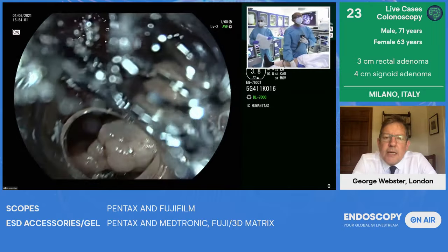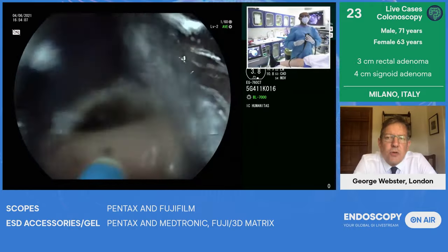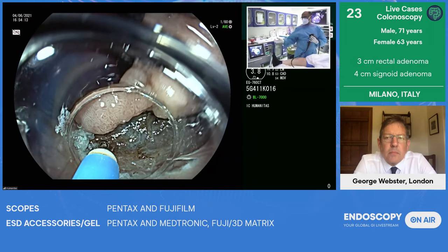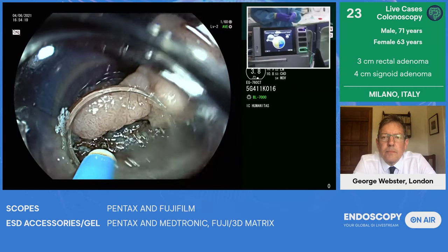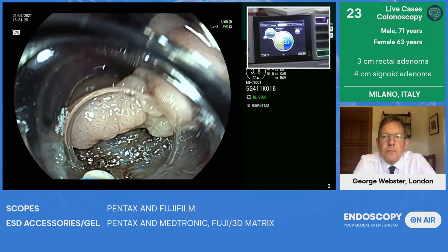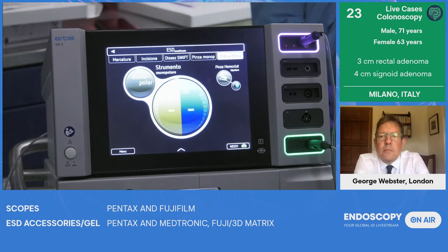Pradeep, do you need to change the electrocautery settings depending on which of the knives you're using? Generally most of the knives work at the same setting, but we have a very modern generator here, which gives you all the clever settings of swift coagulation and soft coagulation, and I have control in my foot pedal with a black toggle, which allows me to shift. If I have a bleed, I press this toggle, you see, it changes to soft coagulation. As I move back to dissection, I press the toggle and it moves back to my setting for dissection. So you can set up a lot of settings.